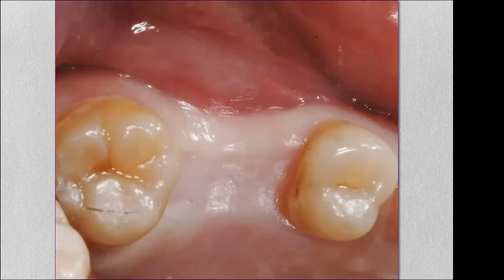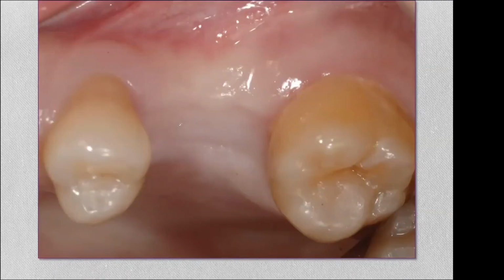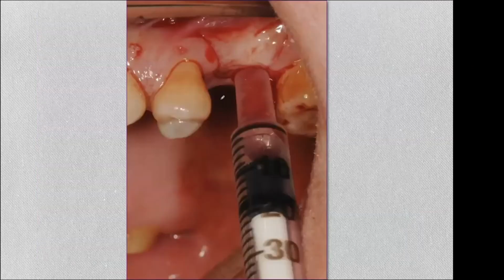And even with a guide, because of the reaming with the Bicon system, it still relies on your ability to maneuver in the area. After about 3 months, this is the clinical presentation. We look at the way the socket healed. We still have nice attached gingiva, but we will not be sacrificing that. So we will open a flap, keeping the papilla. It's a papilla sparing flap.